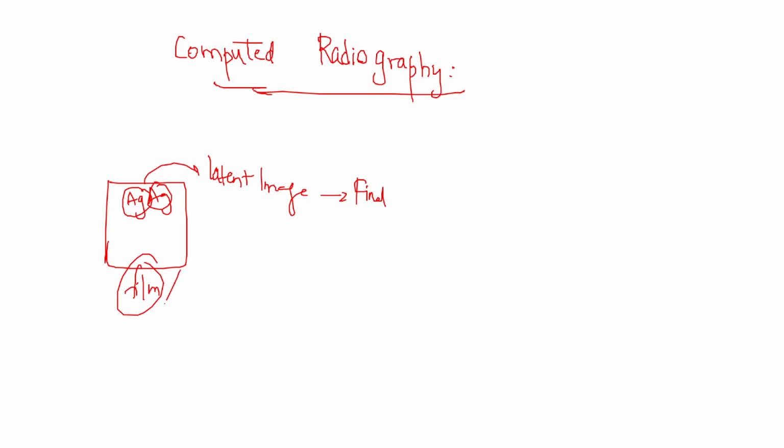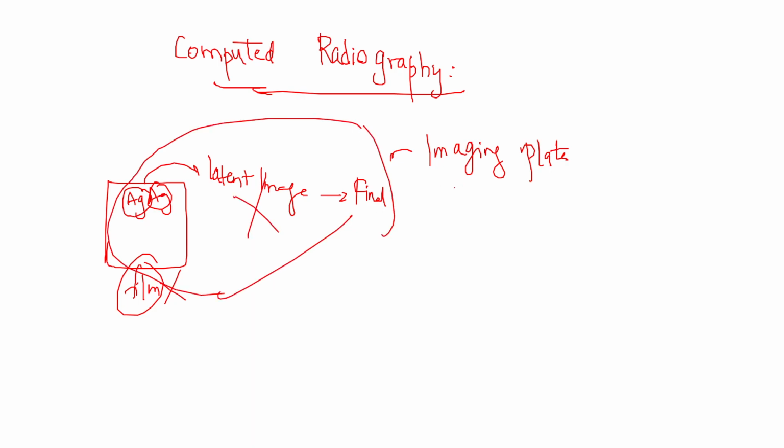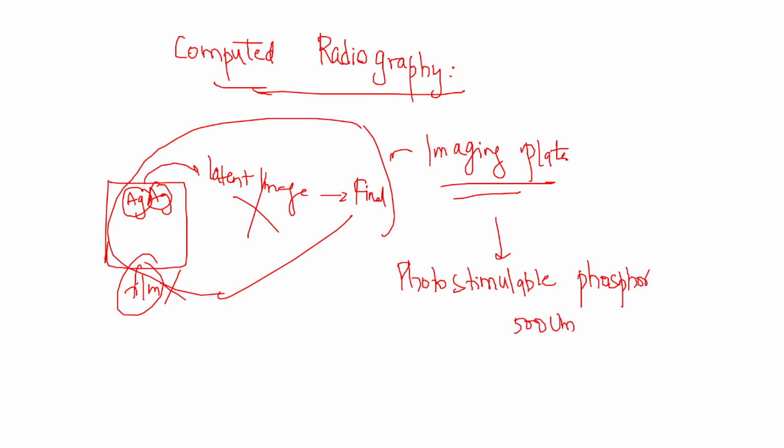But here, instead of having film, we have imaging plates. These imaging plates replace the films in computed radiography. These plates contain photostimulable phosphor molecules which have a thickness of 500 micrometers.